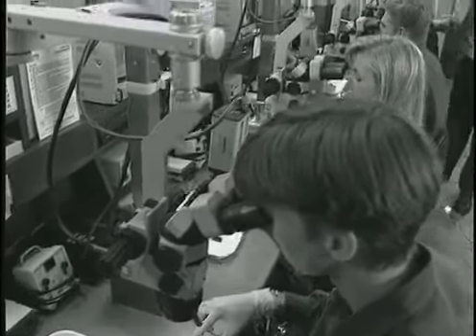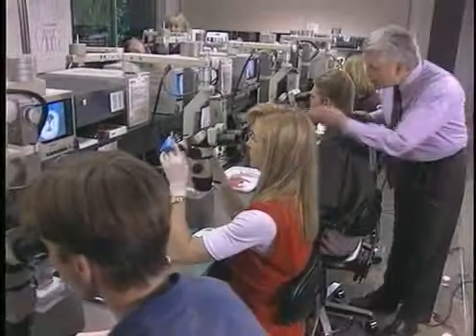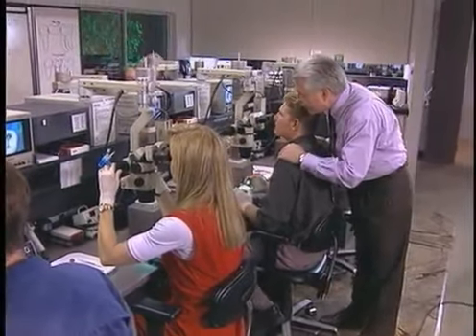Gotten into that. Oh, look up here on the monitor. You just found that second orifice. Good job.